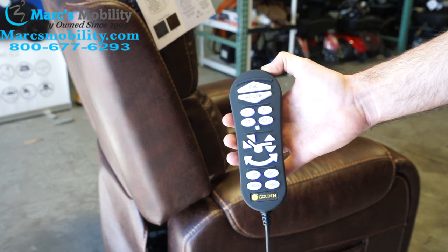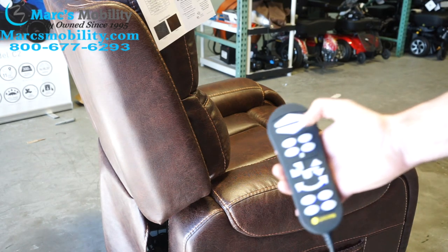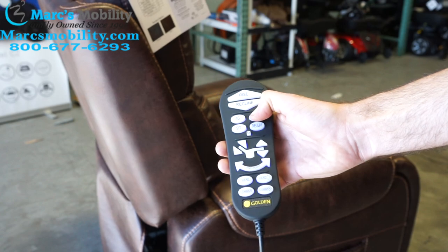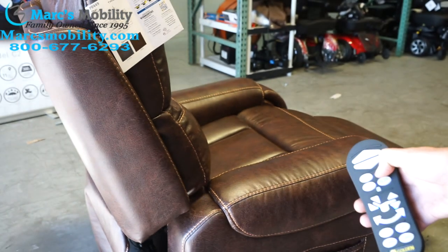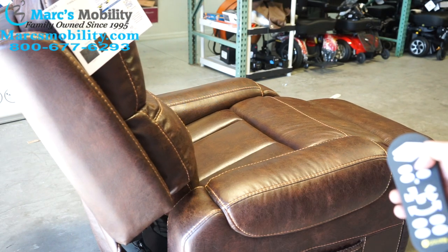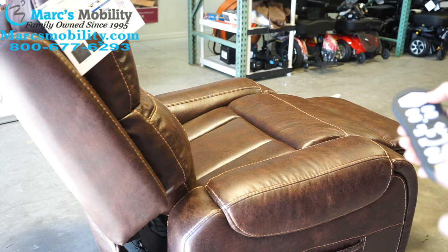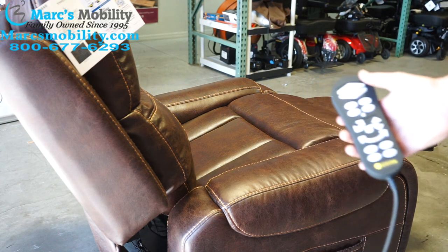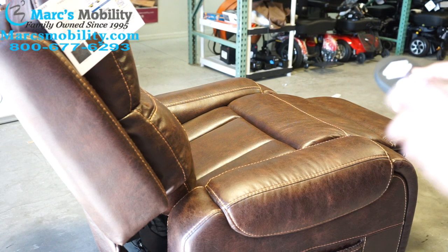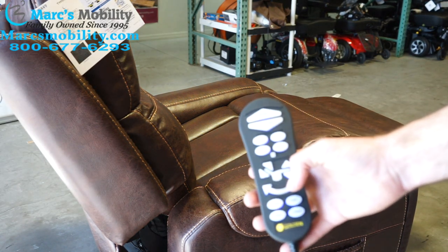You can program these however you want. For example, we're in the sit position right now. If I hold the TV button — see the TV button right there — the chair will move to its factory TV position. This is what Golden thinks is a good TV position. But let's say your TV is higher up on the wall and you want the chair to recline further back so you can see it. We can program the remote to do that.